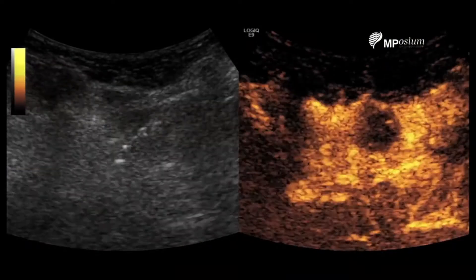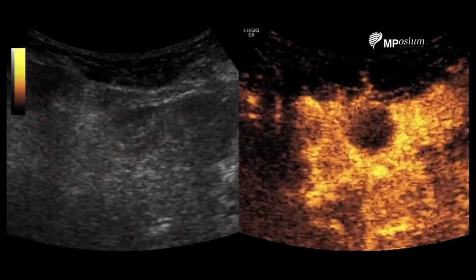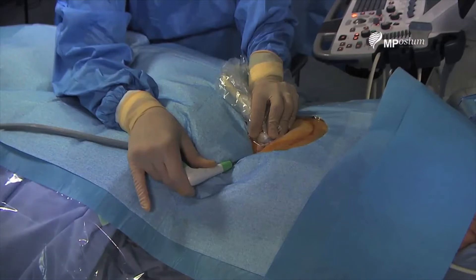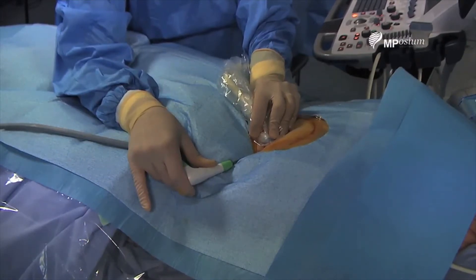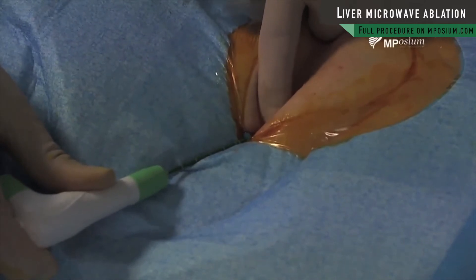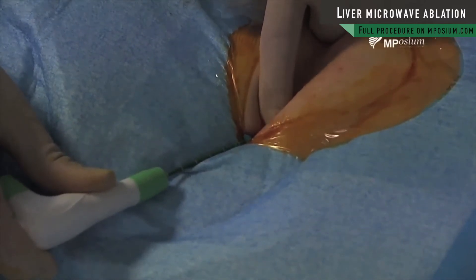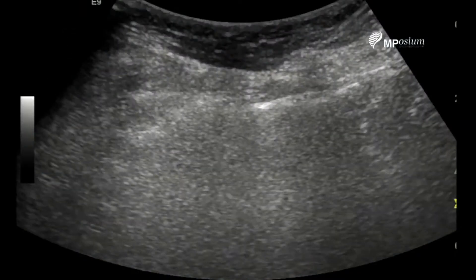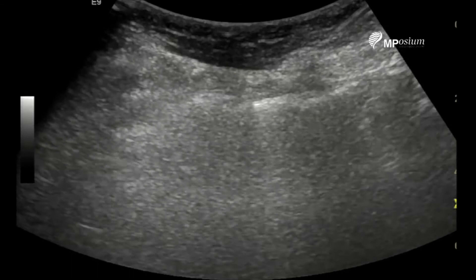I'm totally inside this necrotic lesion. I'm checking that I'm not burning the skin using ultrasound and also with my hand. As you can see, the hyperechoic area of the ablation is extending.